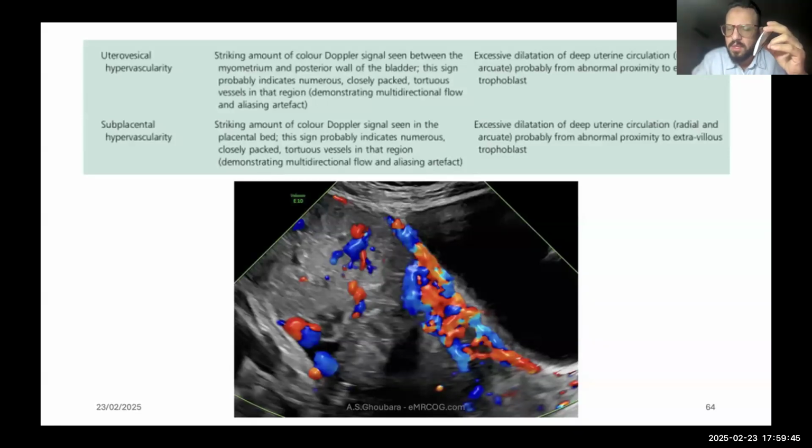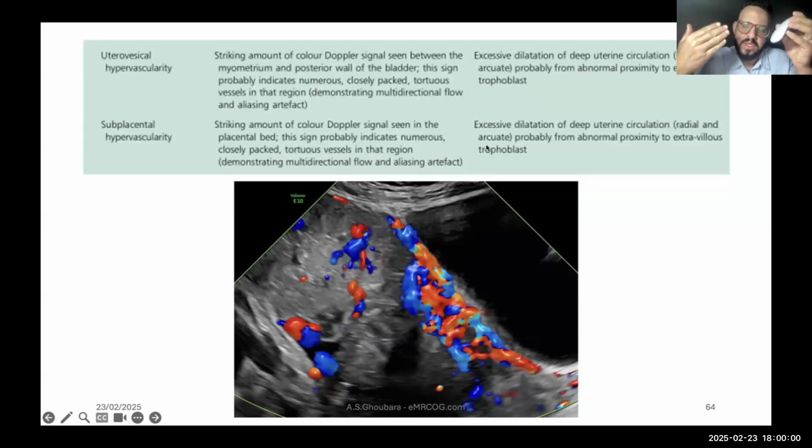It's not an artery and vein. It doesn't work like this. This is the red, meaning the supply of the flow. This is the direction. This is the first information we get from the moving fluid. The blood is moving towards the probe, and it takes a red color. And when the blood is moving away from the probe, it takes a blue color. It's not an artery and vein. So now this is the direction, right?